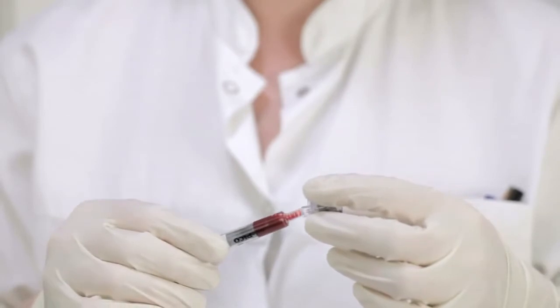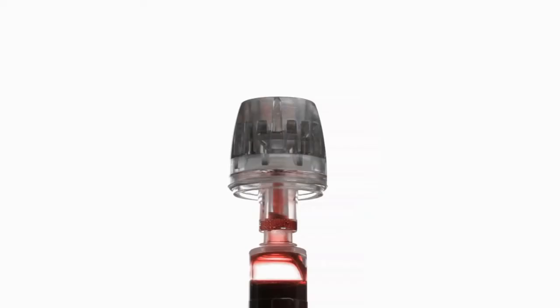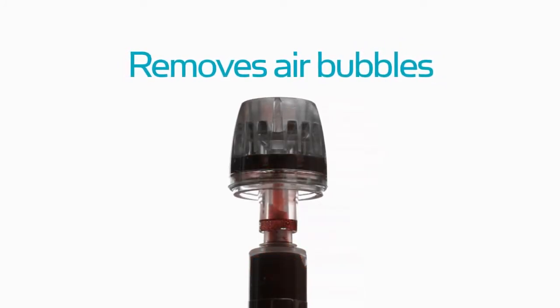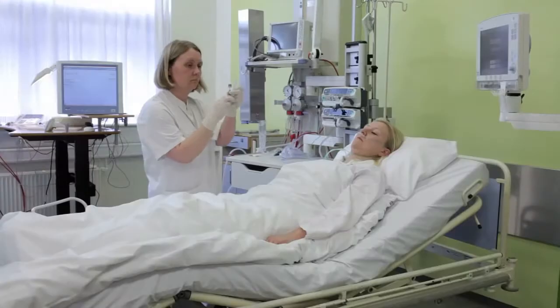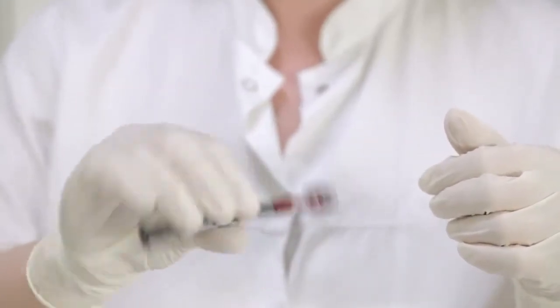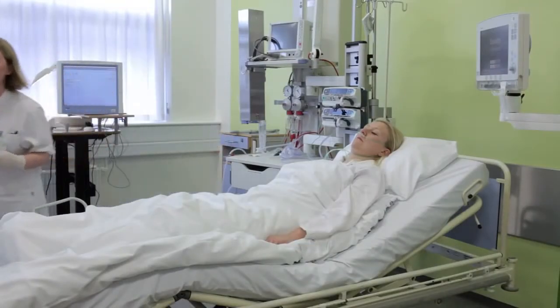The safe tip cap is fitted onto the sampler. By pressing the plunger, the safe tip cap removes any air bubbles present in the sample. The sample is now ready to be mixed. The integrated mixing device shortens the mixing process and ensures the heparin is dissolved throughout the sample.